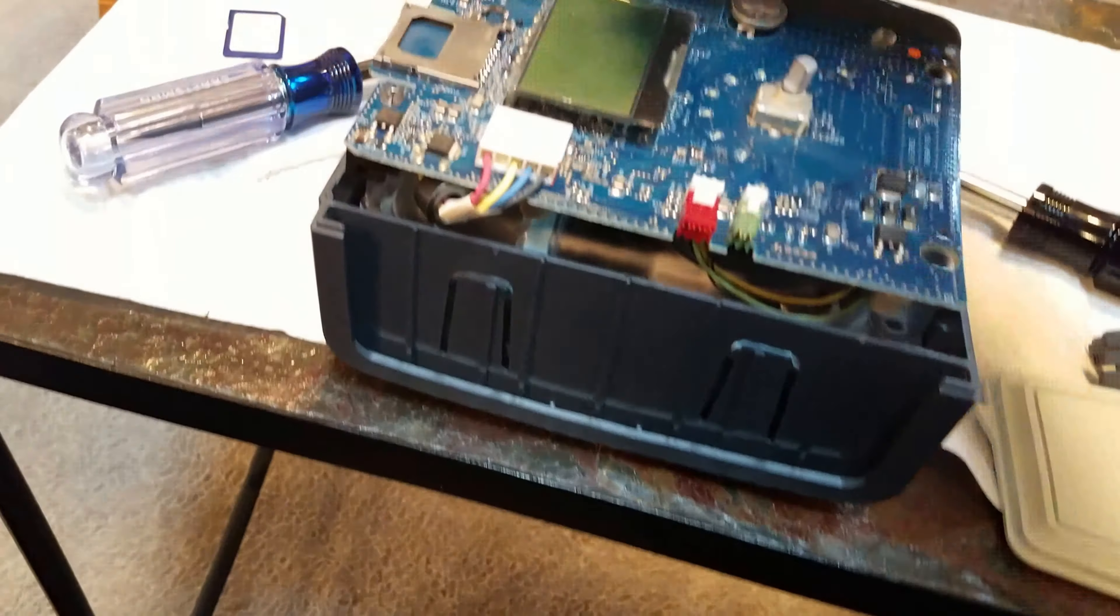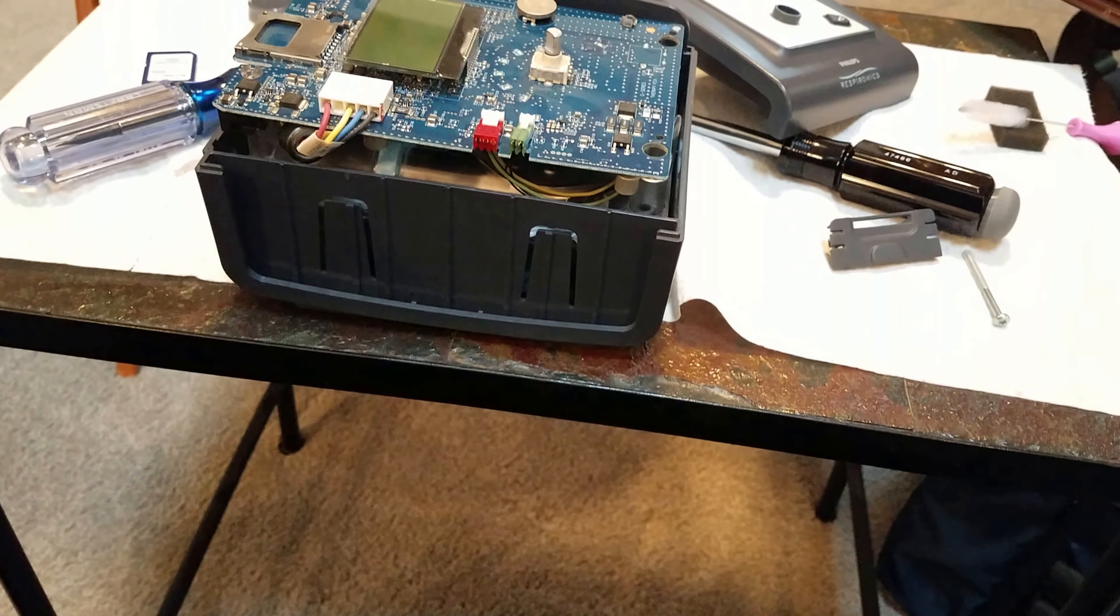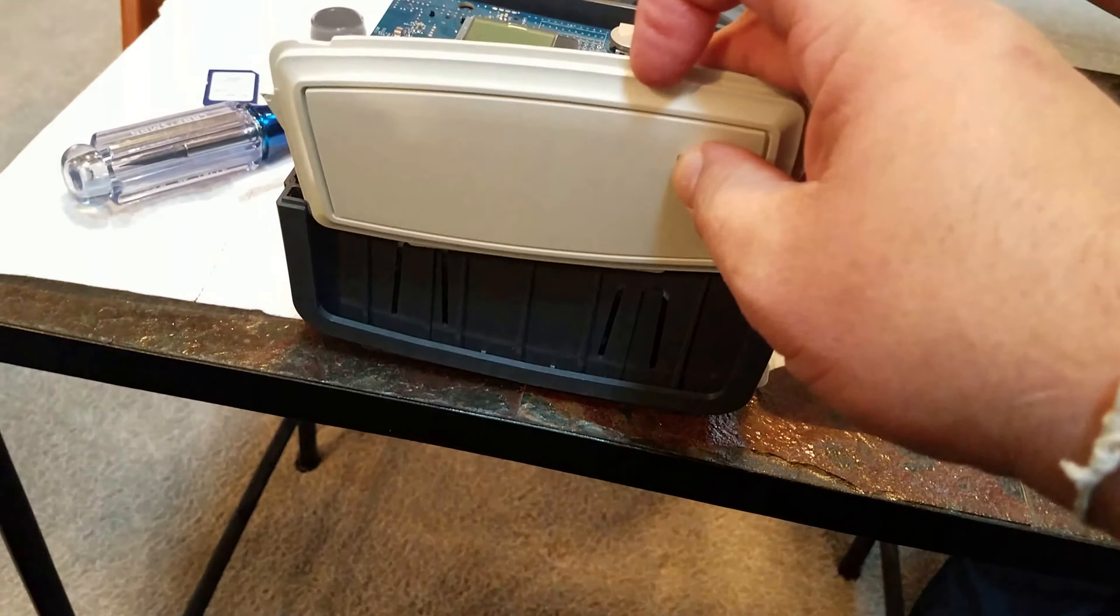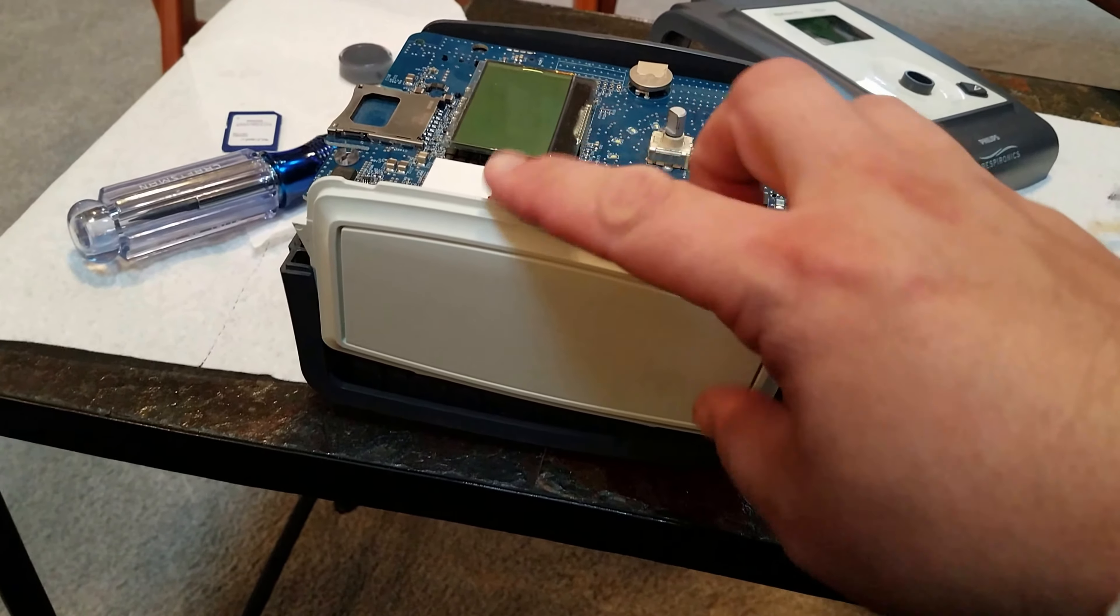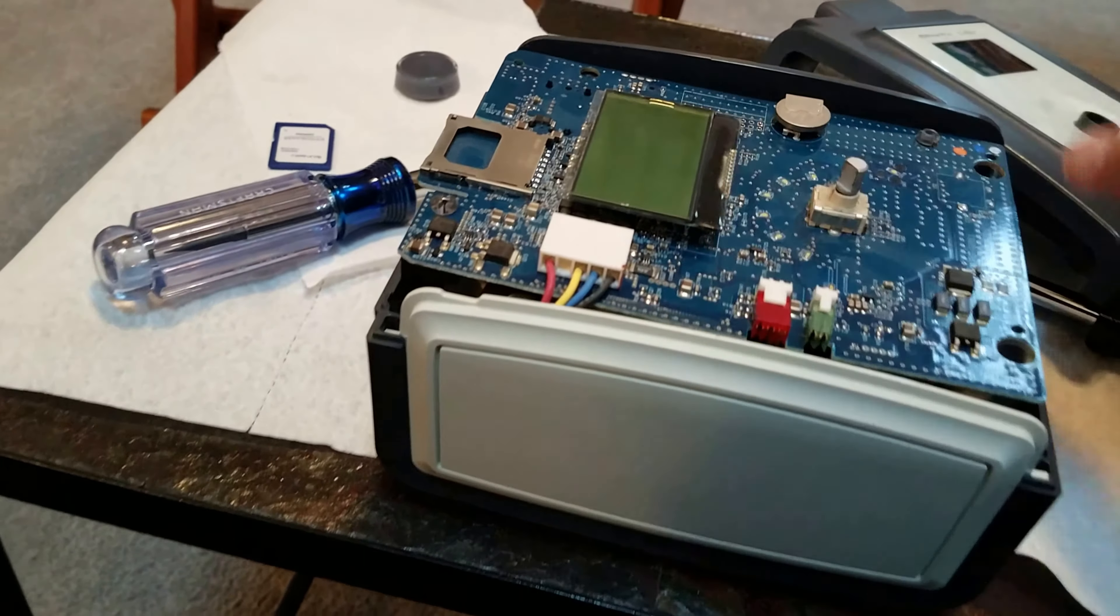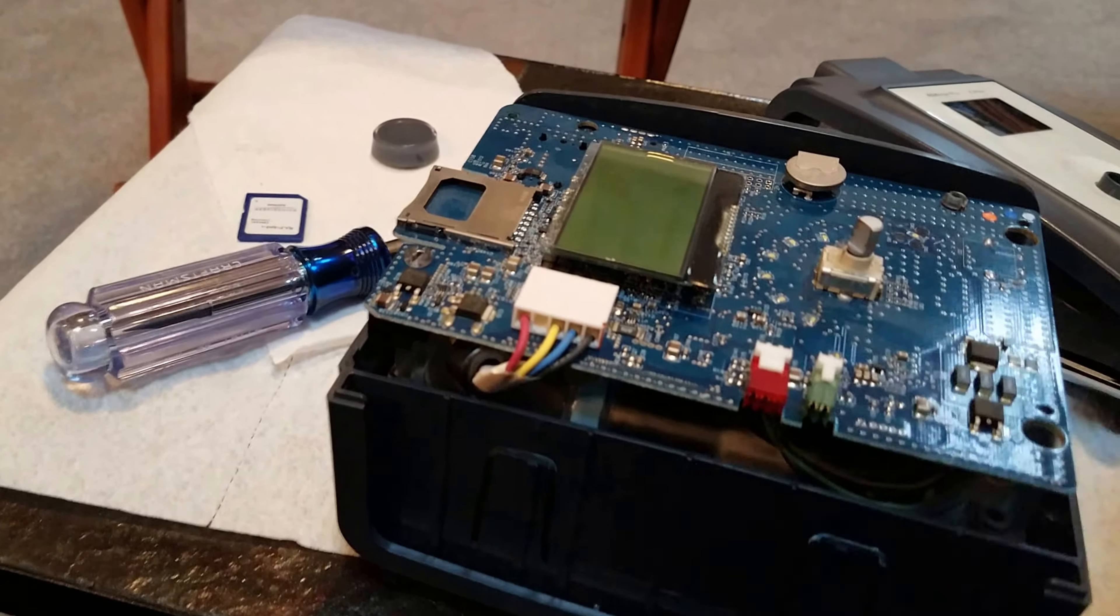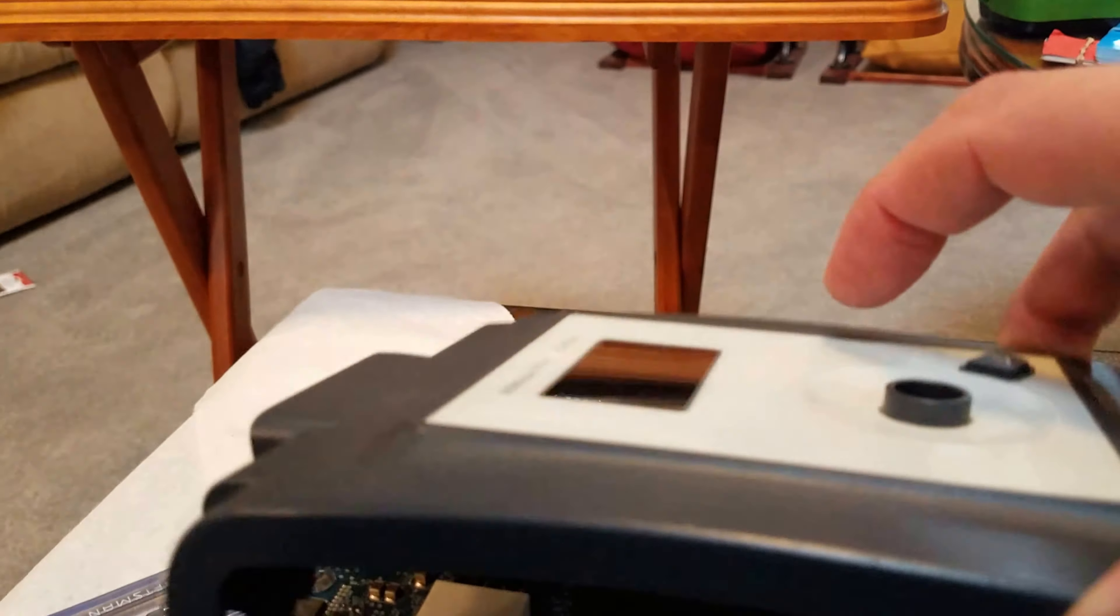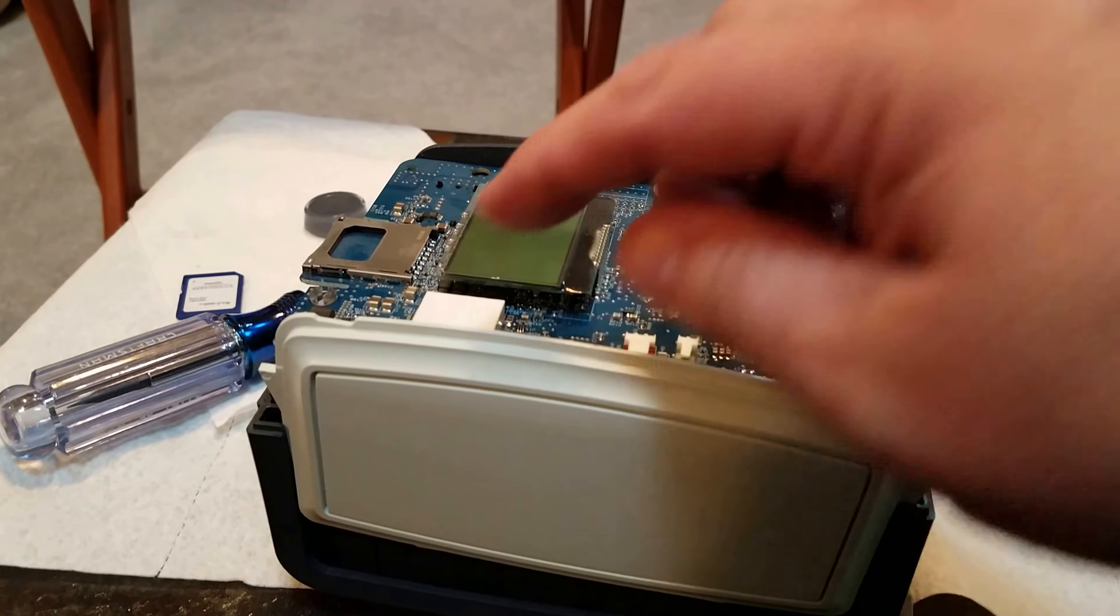Let's see here. I believe it goes in this direction. And it pops in. Otherwise, you're going to have exposed wires where you can see these wires. When you put this sucker on, so you put that on, it'll cover up those wires, make the end look nice and clean.